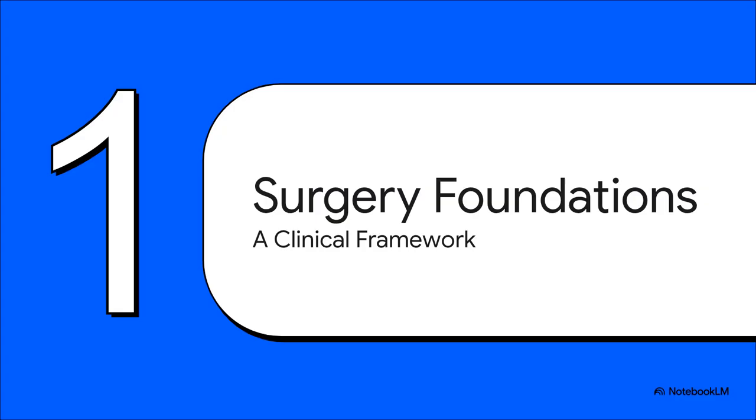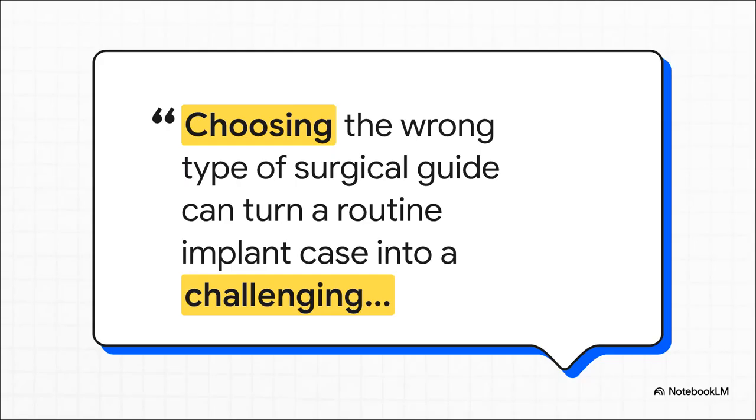Starting off with Section 1, Guided Surgery Foundations. The stakes in modern guided implant surgery are incredibly high. Human anatomy varies drastically from person to person, so a one-size-fits-all approach simply doesn't work. As the source material perfectly puts it, choosing the wrong type of surgical guide can turn a routine implant case into a challenging procedure with compromised accuracy.